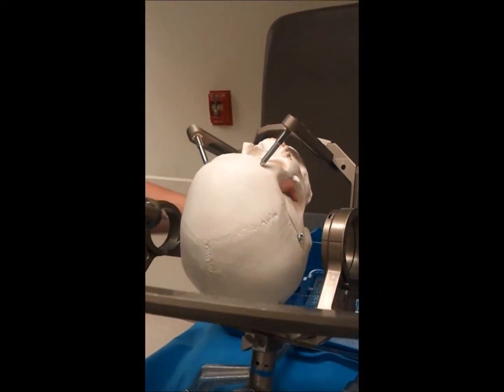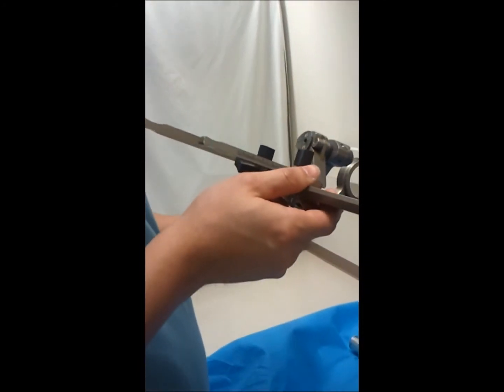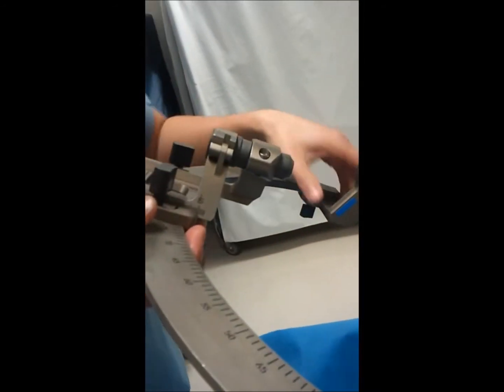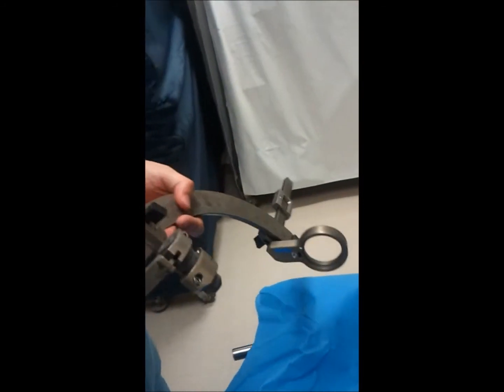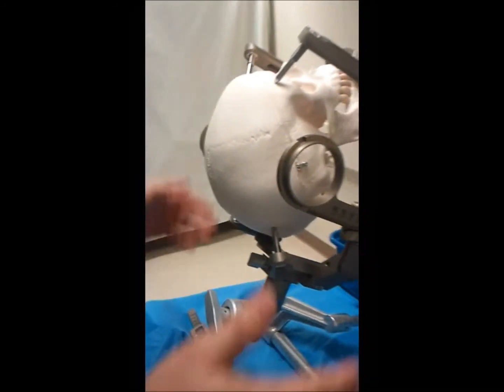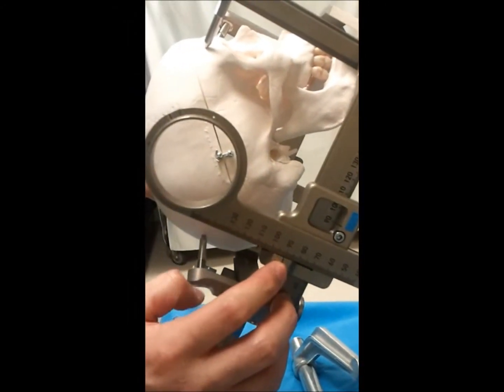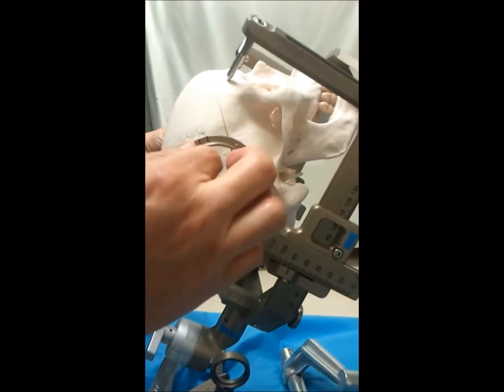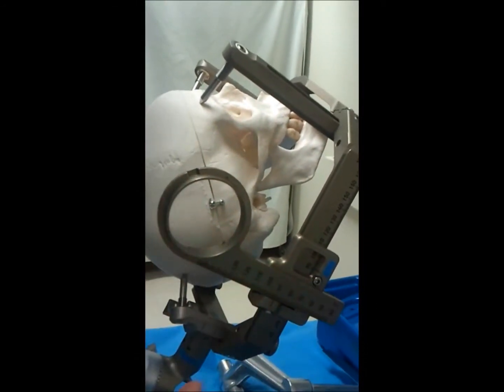Okay, so as I take these reduction tubes out, just to re-review, placing this on one more time as I take it off. It's very important that we set the vertical position on first before we even attempt to put these rings on the side rails of the Leksell coordinate frame.